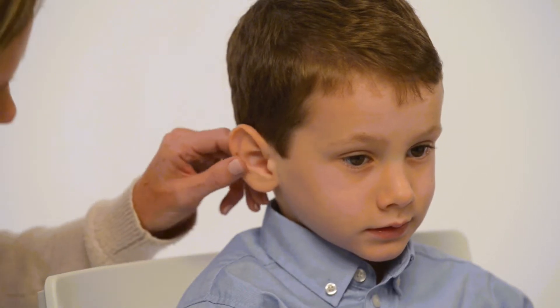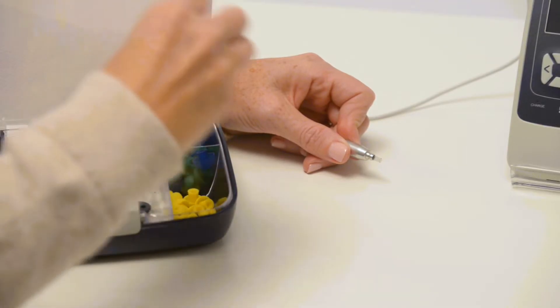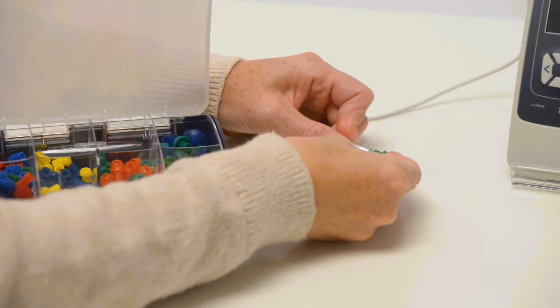Make a visual inspection of the ear canal and choose an ear tip based on ear canal size. Make sure the ear tip is pushed down to the end.